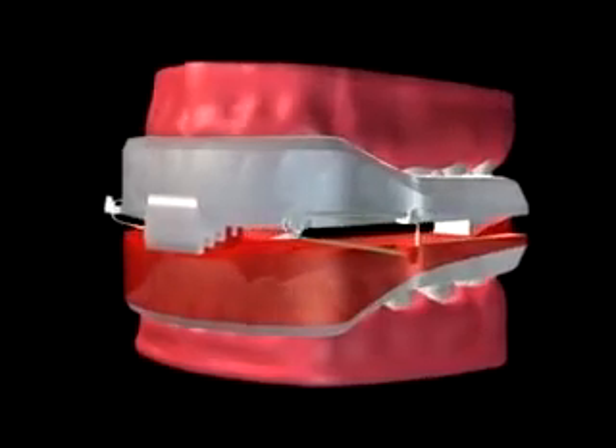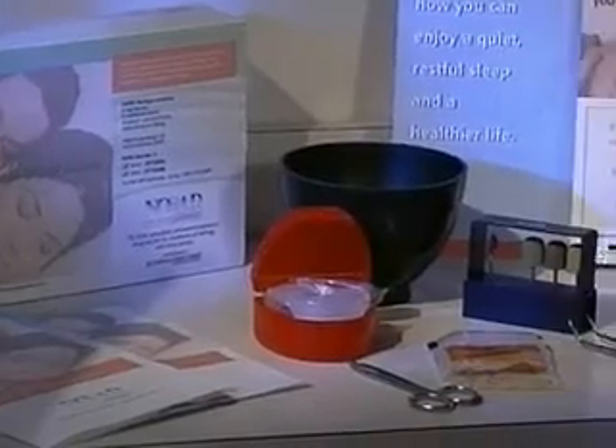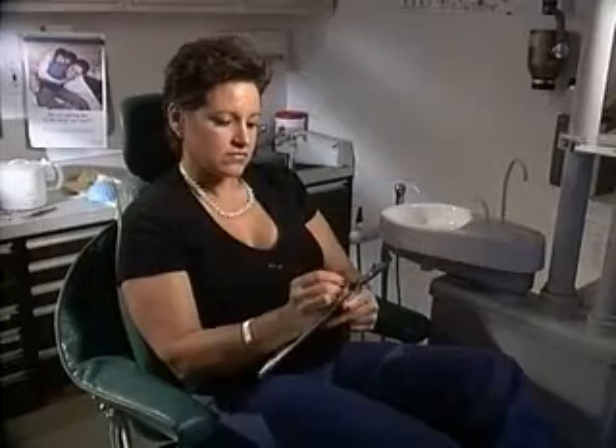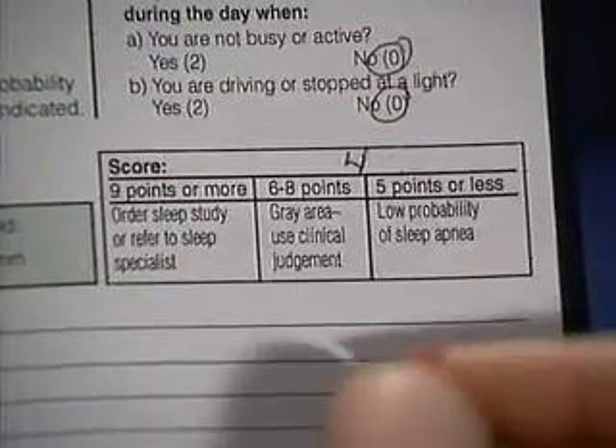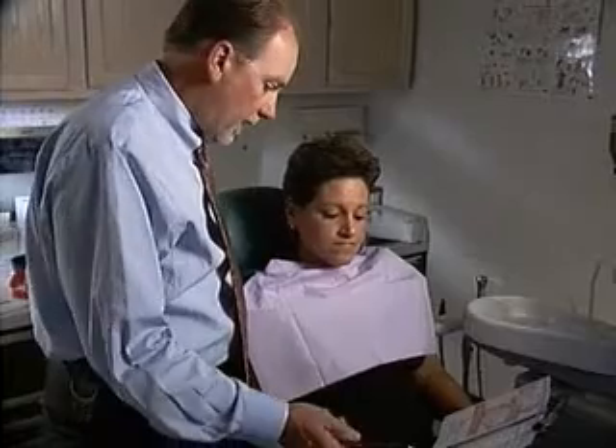To achieve maximum effectiveness and comfort with NORAD, please follow the following instructions carefully. Before proceeding, have the patient fill out the sleep worksheet contained in the NORAD patient care instructions. If their score determines they have a reasonable probability of being at risk for sleep apnea, it's recommended the patient consult with their physician or be referred for an overnight sleep study prior to any further sleep disordered treatment.